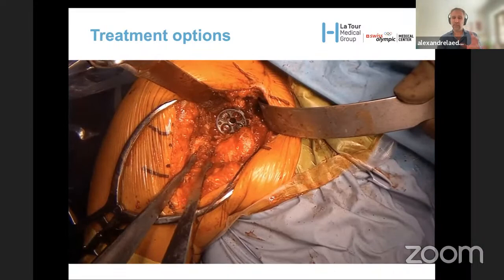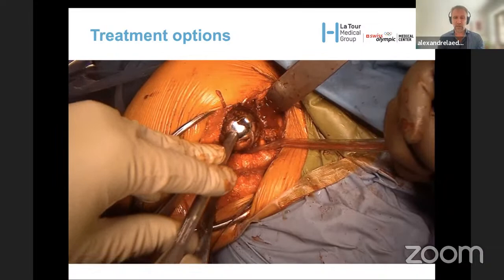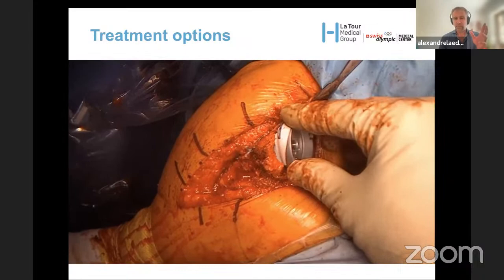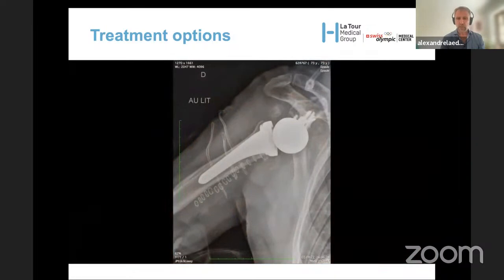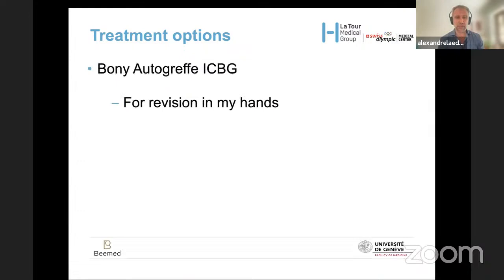We did not observe any neurological lesions after this procedure. We hope the conjoint tendon will have the same effect as in Latarjet, meaning it could prevent dislocation when the patient has the arm in abduction and external rotation. This is the postoperative X-ray — quite an elegant technique.